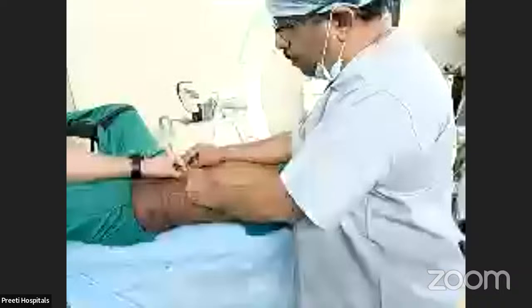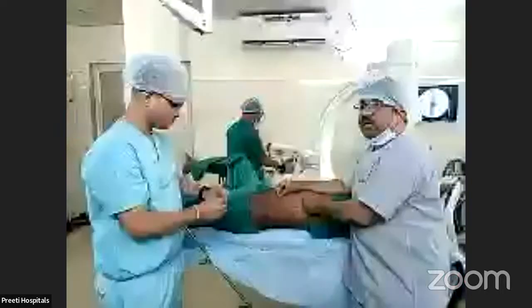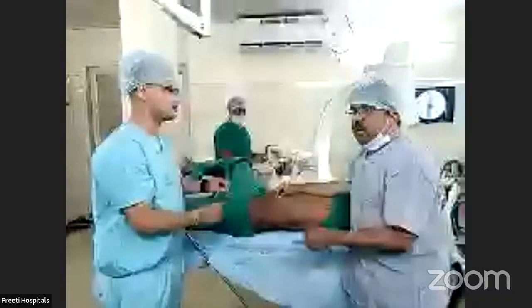If a large stone is there in the superior calyx, you will prefer prone, because then we can come from the middle calyx and reach the upper calyx. But for such a small stone, why take a supracostal approach? You negotiate and take it.